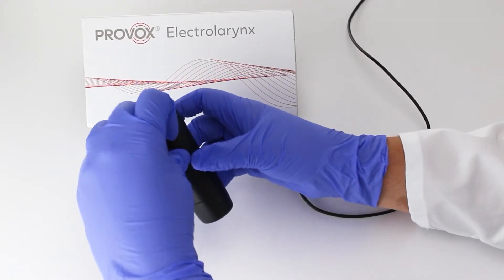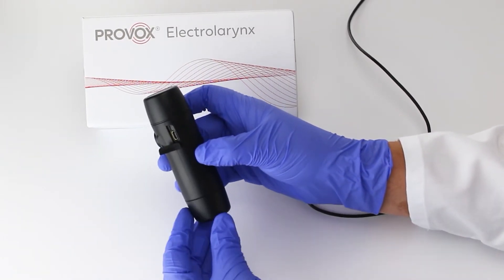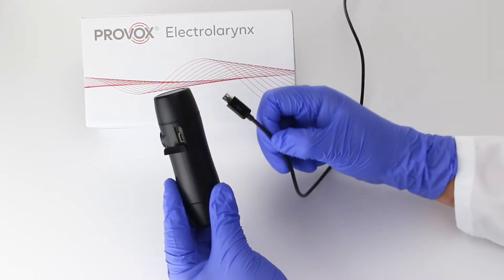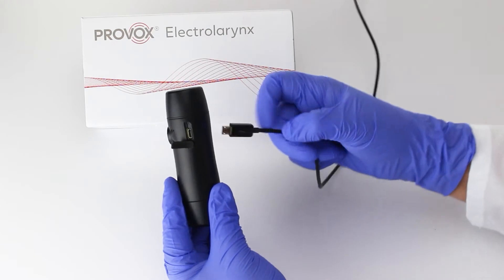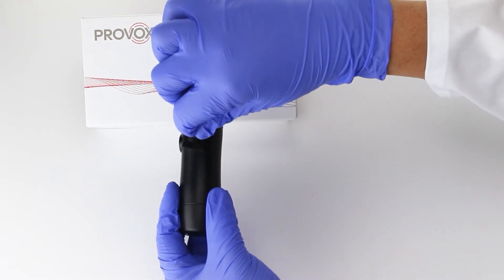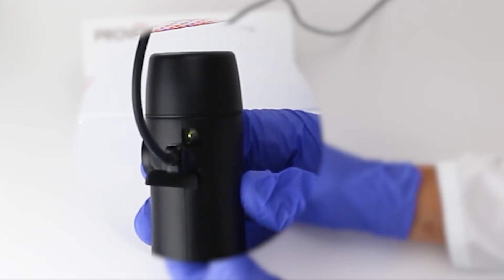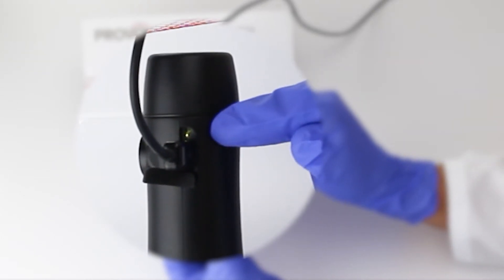To charge, remove the dust cover from the USB port on the side of the device. Then take the provided USB charger and make sure it's properly inserted into the USB port. The LED light will illuminate showing the device is in charge mode.